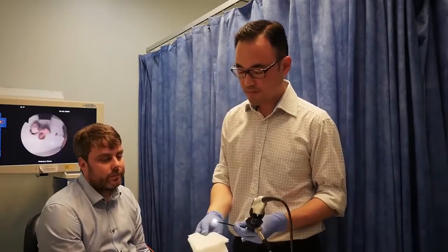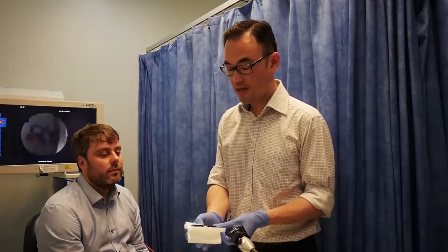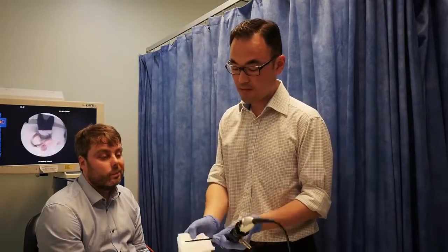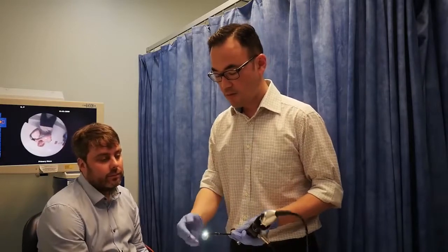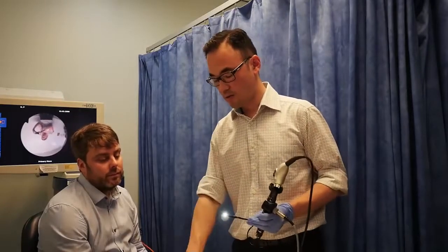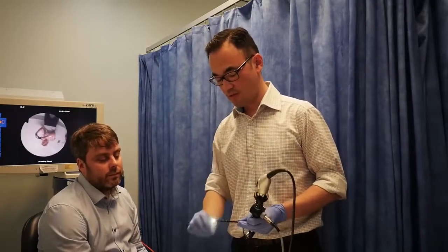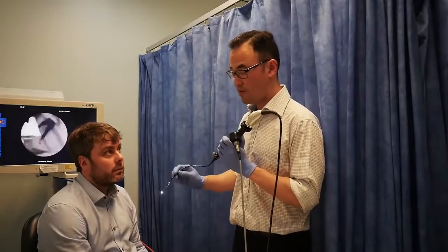I'm just going to put the lubricant just on the scope, but avoiding the tip, because if not, it will affect your view. And after that, we've got to do something to prevent fogging of the tip. Now, you can use either an alcohol swab to rub on the tip of the scope, but I tend to just ask the patient to put a dab of saliva onto the tip of the scope.